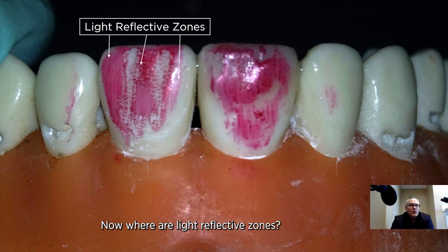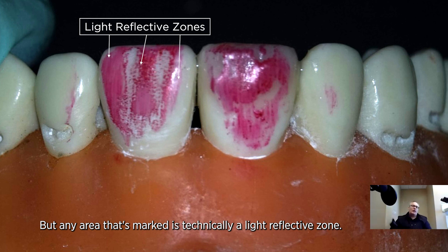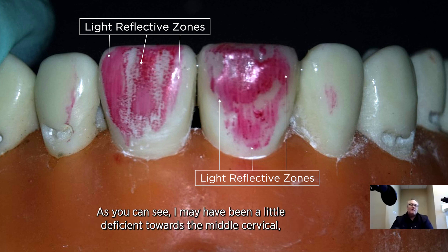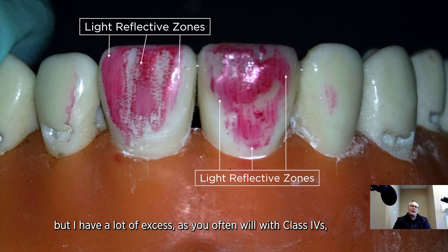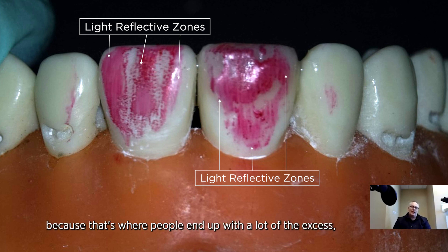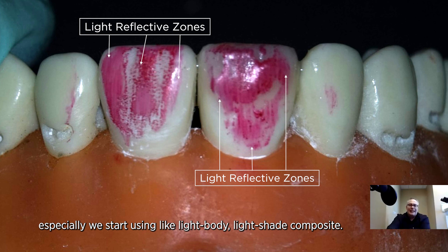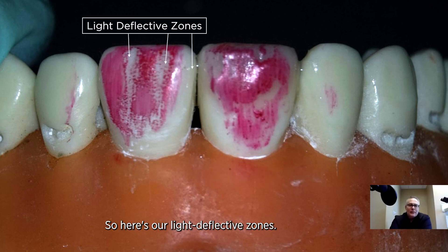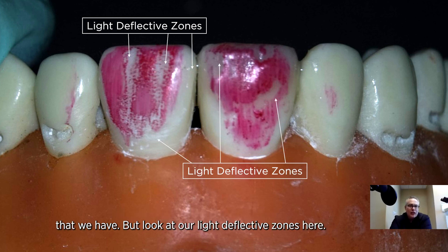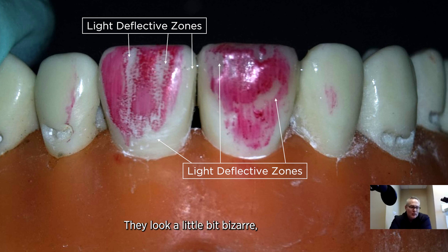Where are our light reflective zones? We talked about our mesofacial line angle, but any area that's marked is technically a light reflective zone. Here are our light reflective zones on the adjacent tooth. I placed the composite, and as you can see, I may have been a little deficient towards the mid and cervical, but I have a lot of excess, as you often will with class fours. Where you see that excess light reflective zone in the middle is where people end up with a lot of excess, especially when using light body or light shade composite. Your job is to make it even. Here are our light deflective zones — that's the interproximal area and these two facial depressions. But look at our light reflective zones here: they look a little bizarre and strange, and that's because of the excess.